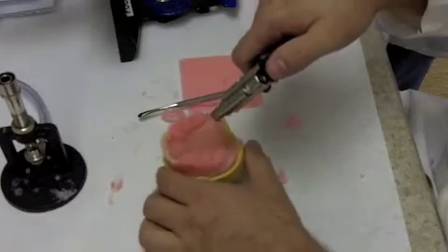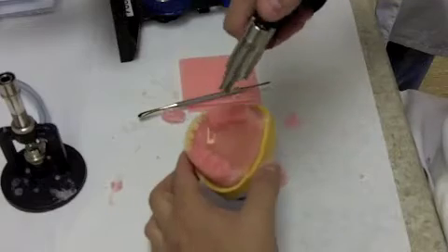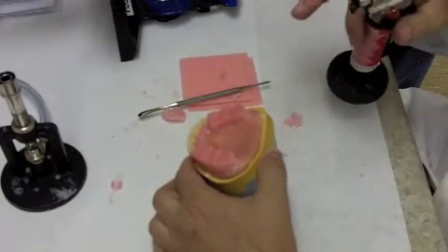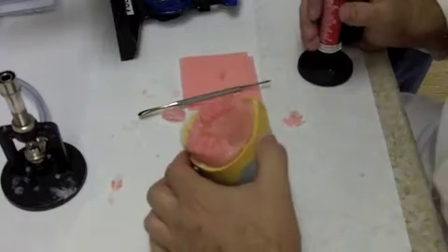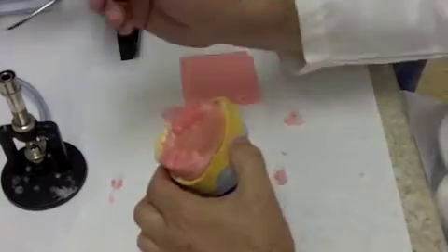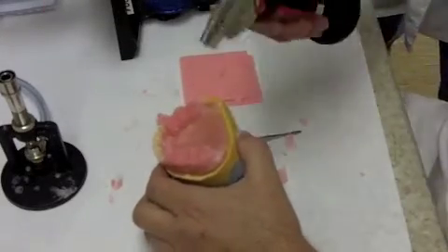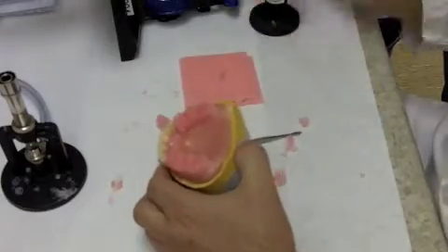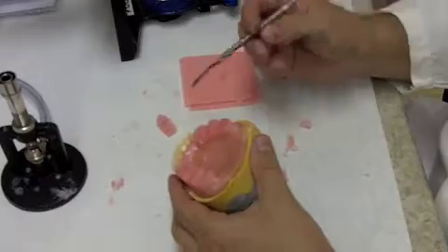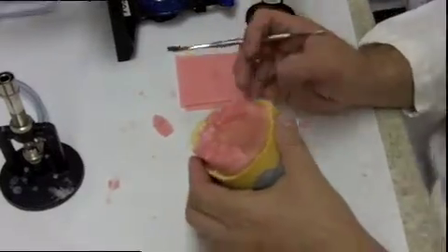Once you have the wax removed, you can come in with a blazer torch and very gently heat things — you don't really want to liquefy the wax, you just want to heat things enough to get a nice smooth surface. Just a very light flaming. If there are any voids, take some more wax and add it, then gently flame it so you end up with a nice smooth transition. That gives us what we want with our maxillary anterior teeth.